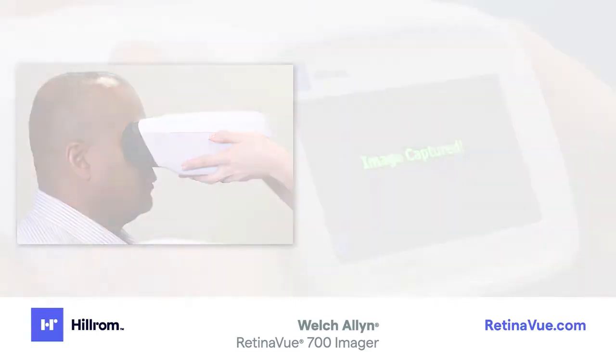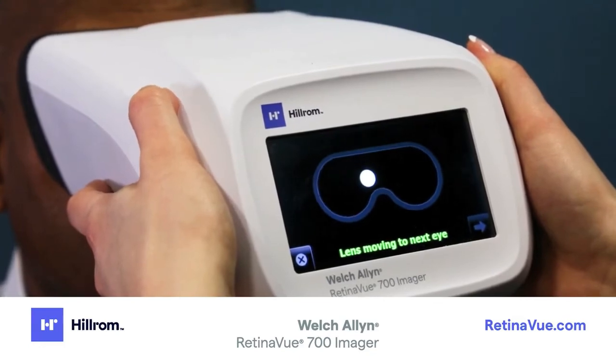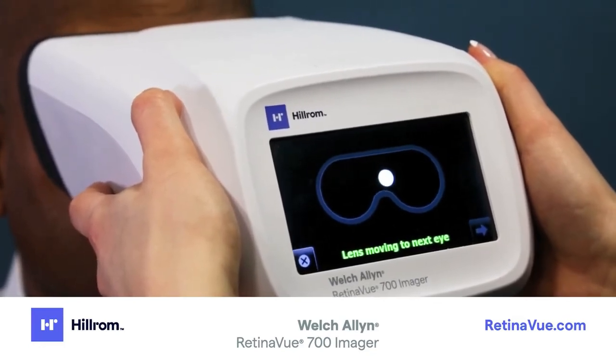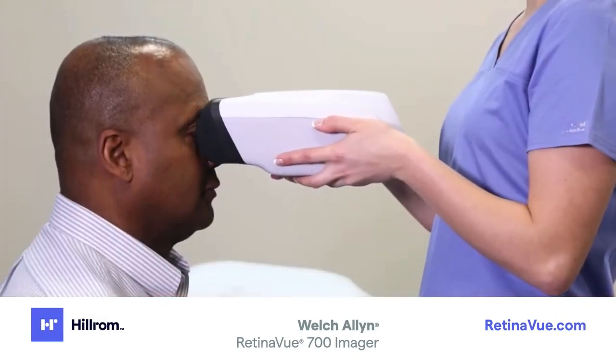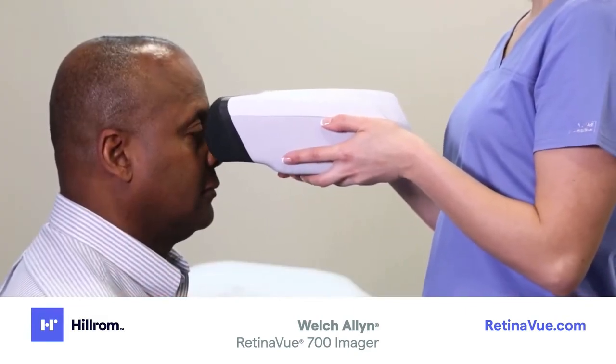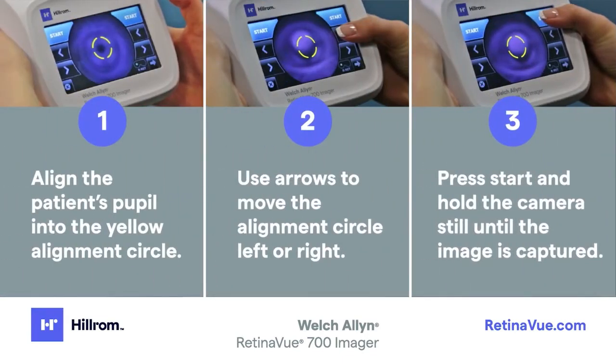Direct the patient to hold steady until the image is captured. Once the image is captured, the imager will automatically move to the left eye. During transition, you can either leave the imager on the patient's face or remove it while the imager transitions to the left eye. Repeat the steps to align the pupil to the yellow circle and capture an image of the left retina.